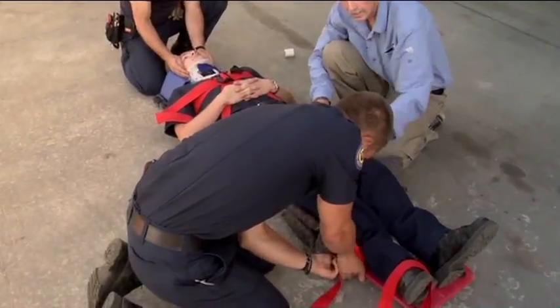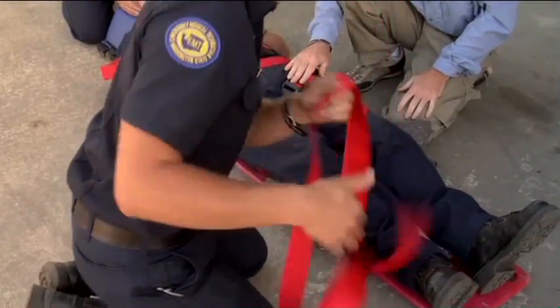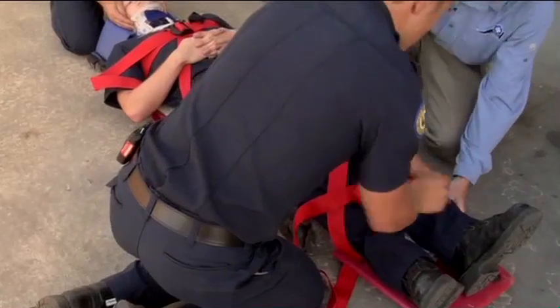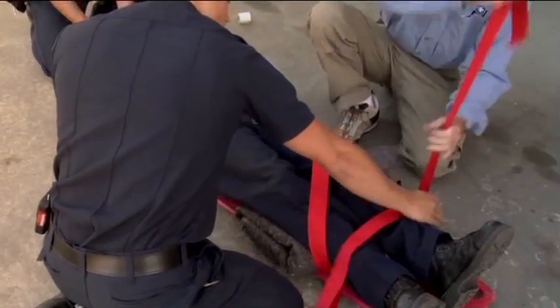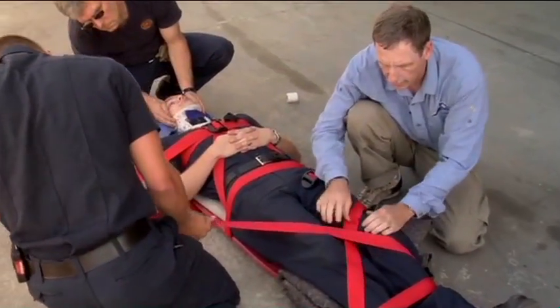See how we're crossing the knees here? Very well done. And we're going to cross back. You see we're not on the kneecaps at all.